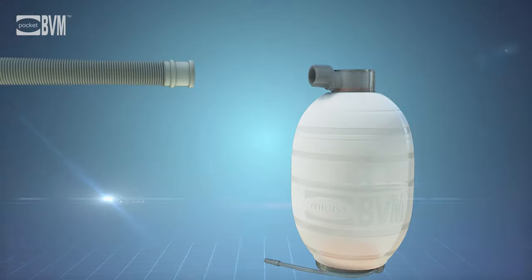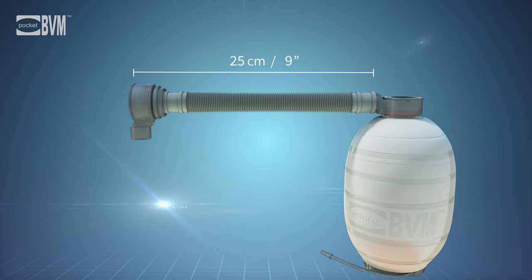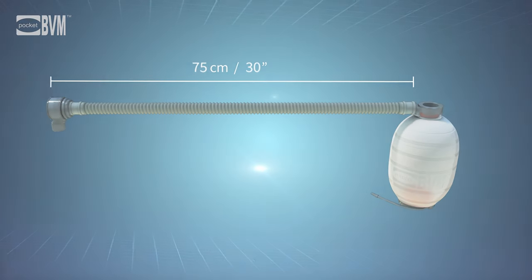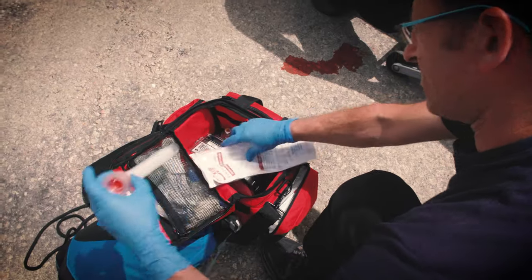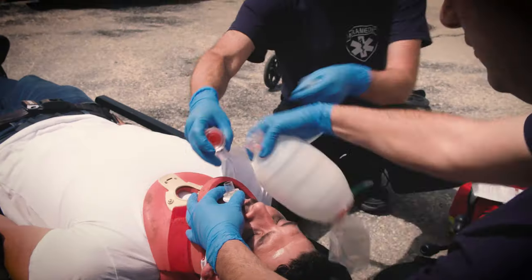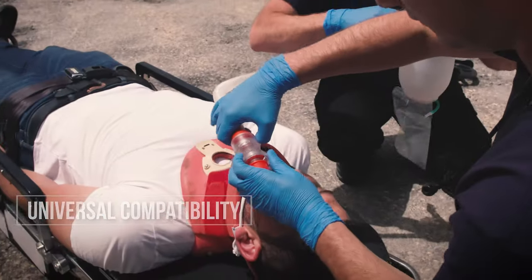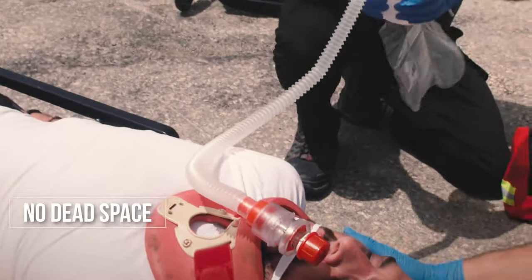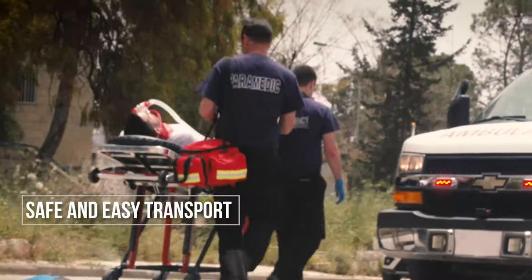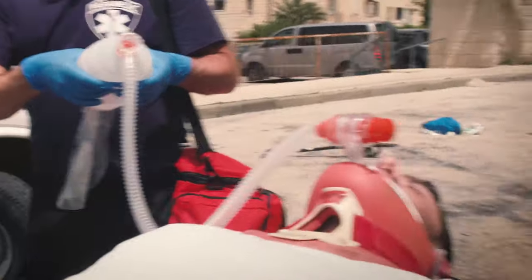The Micro BVM Extension Tube is a real game changer in the field of airway management. It is the only tube on the market that can extend up to 30 inches or 75 cm. The Micro BVM Extension Tube is durable, compact, easy to assemble, and compatible with all adult BVM models. Its T-valve guarantees there is no dead space, enabling safe and easy transport of intubated patients and reducing the risk of unwanted extubation.